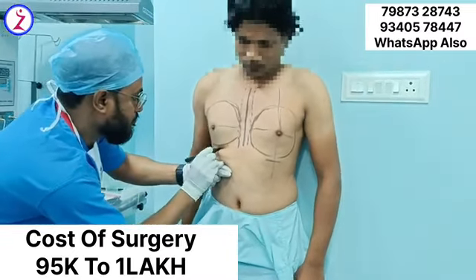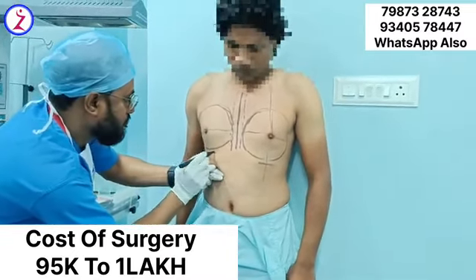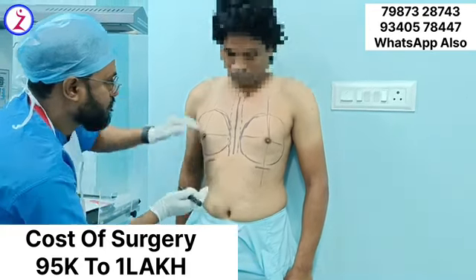So this is the complete marking for breast augmentation in trans female patients. We'll do the surgery now.